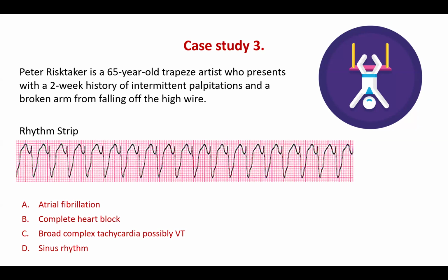It's going to sound funny, but they were talking about breast implants and the placement of the chest leads. I think it's not an exact science, and you just do what makes sense at the time. This is a really common question, like women with large breasts, where to put those chest leads. The limb leads are pretty straightforward. The chest leads often cause more problems. I would just go for whatever's the most anatomically correct.